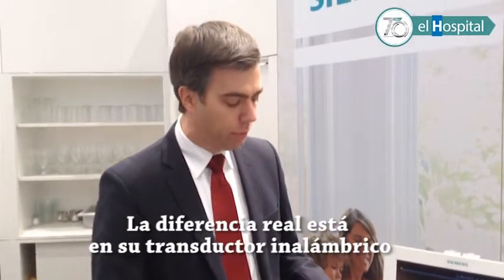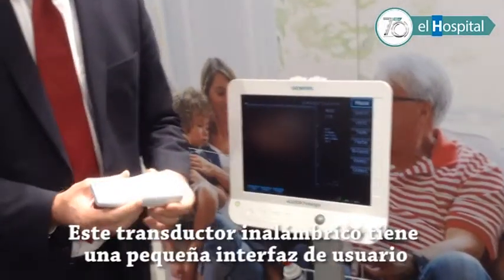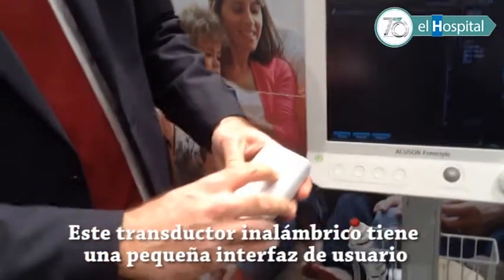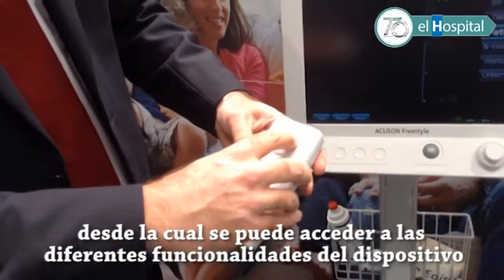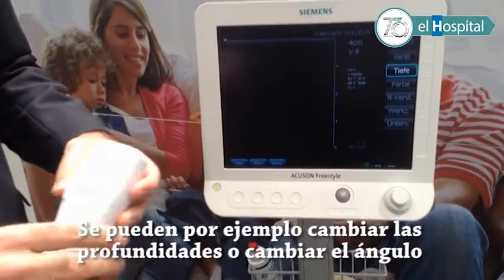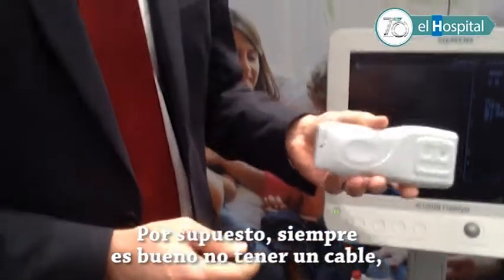The real differentiator is the wireless probe. You can see this wireless probe even has a little user interface here. You can go into the functionality — you can, for example, change the depth or change the gain. And of course it's always nice to not have a cable.